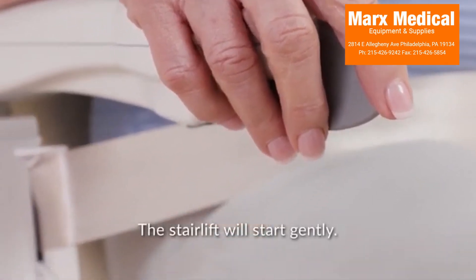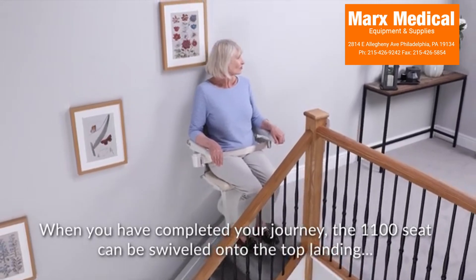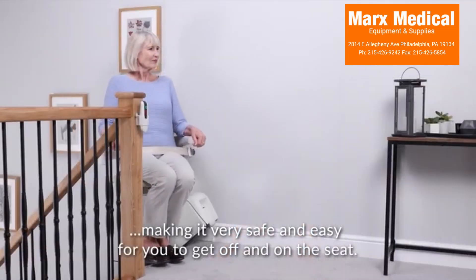The stair lift will start gently. When you have completed your journey, the 1100 seat can be swiveled onto the top landing, making it very safe and easy for you to get off and on the seat.